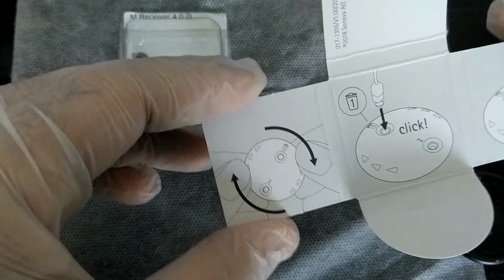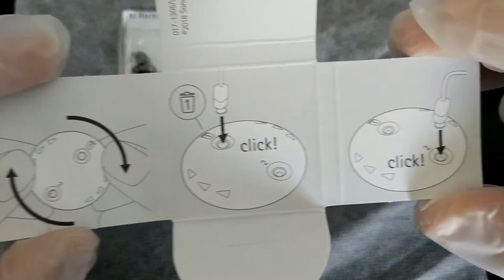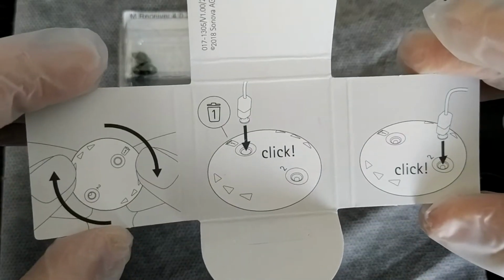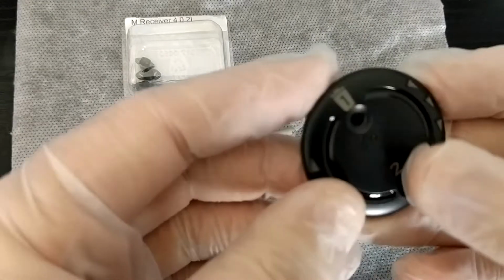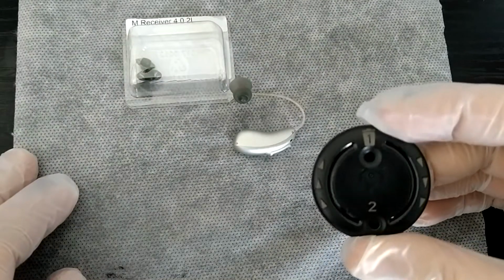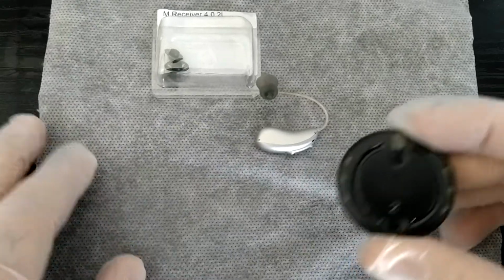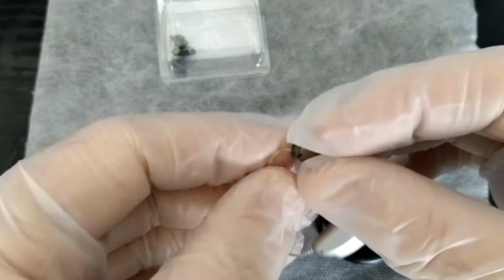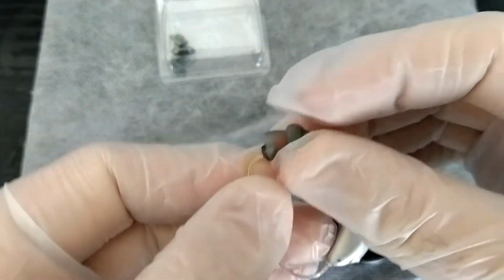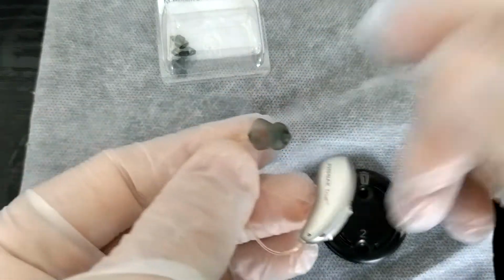You've got the instructions there on how to remove your Cerushield discs on your receiver in the canal Phonak M series hearing aid. If you have a look at the hearing aid itself, you've got red for right, you've got the dome itself. This is a power dome.